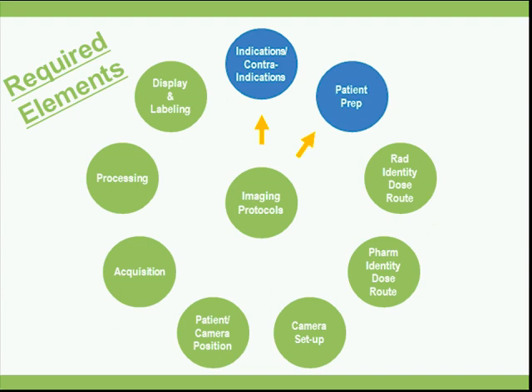The protocol must list patient preparation and education instructions such as food and diet restrictions, if any, withholding or non-withholding of medications or other relevant information. For instance, for adenosine stress myocardial perfusion imaging, the patient must avoid caffeine for 12 to 24 hours, and theophylline medication should be withheld for 24 to 48 hours. Other patient instructions may include skin preparation, wound care, changing or removal of dressings or casts for general nuclear medicine, and blood glucose levels for PET scanning. If there are no patient preparations or restrictions, the protocols must specifically state this.